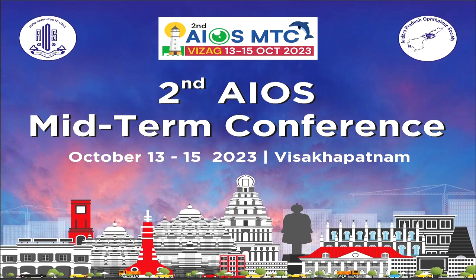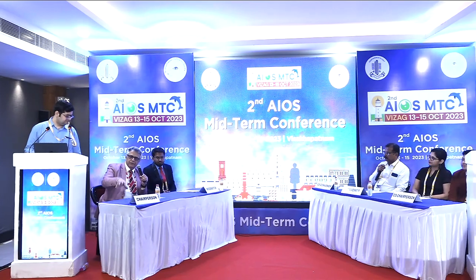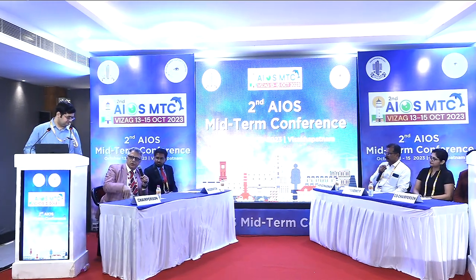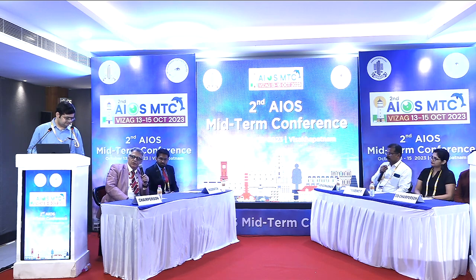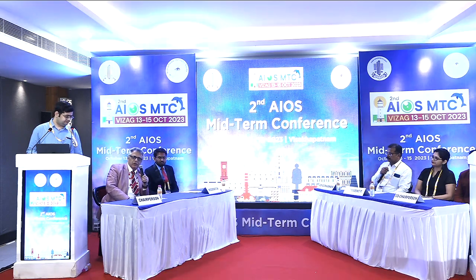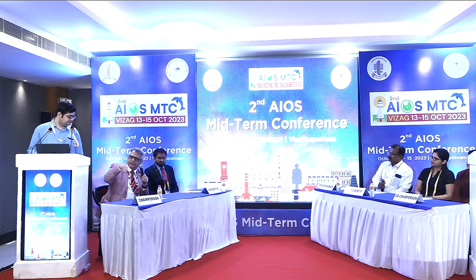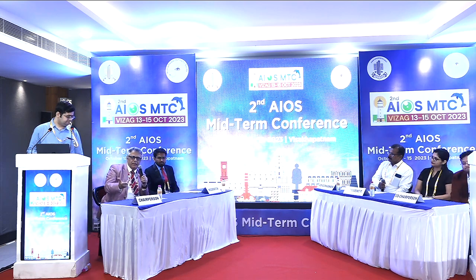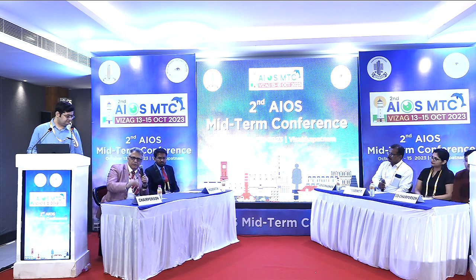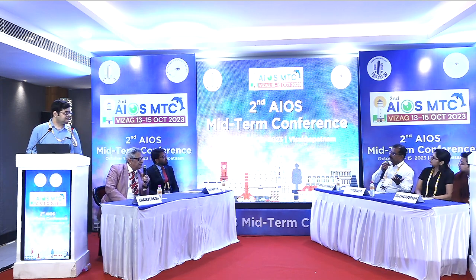It was a really very nice picture. I was just wanting, and you answered in the last slide itself, that presence of so much of CNP areas does call for ablating these areas, because of increased VEGF load. But these collaterals are known to cross the horizontal raphe, and they are friendly vessels. We should laser beyond these vessels, because they are all friendly vessels. And actually, there is an indication of doing laser in such cases.